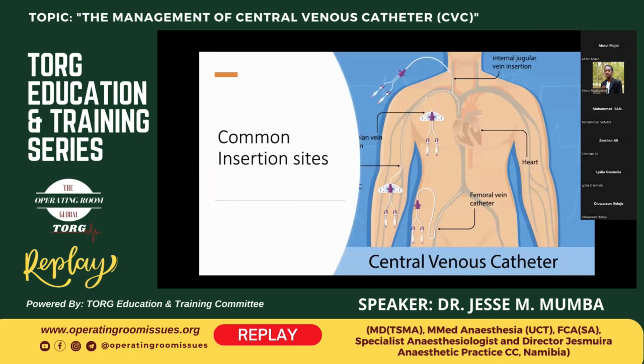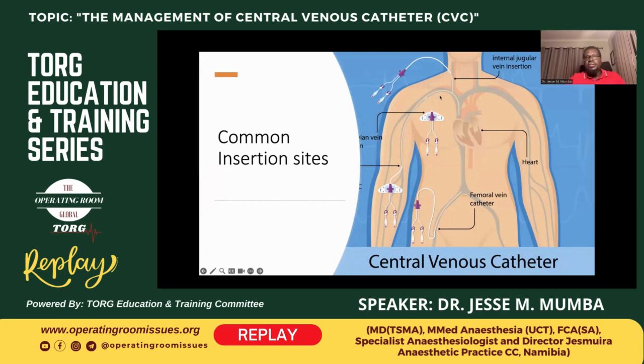The common sites where we place these central lines: we've got the internal jugular, which is up here, if you can see my cursor. Then you place them in the subclavian veins. We also place them in the femoral veins.